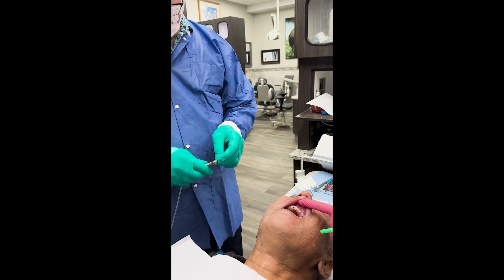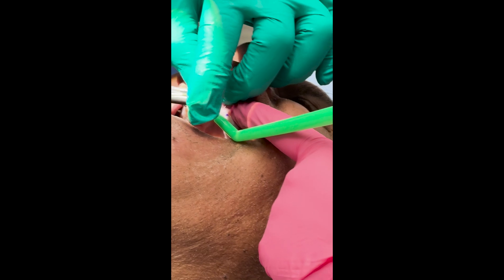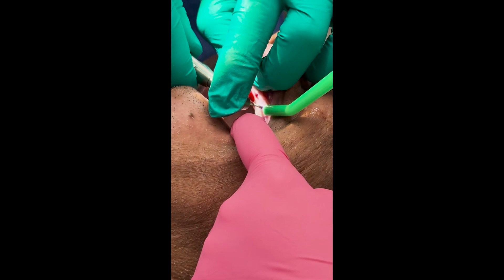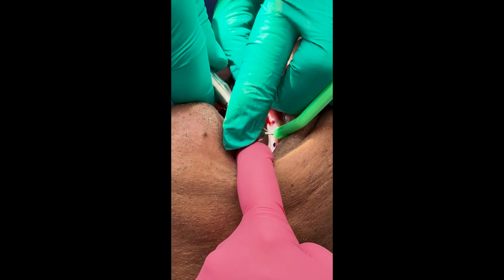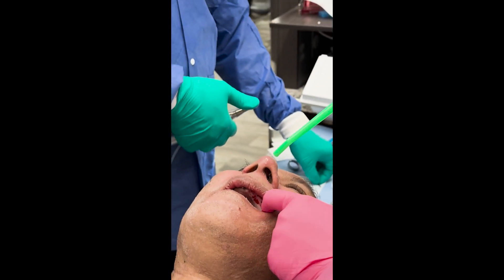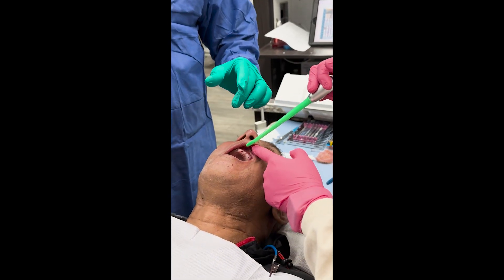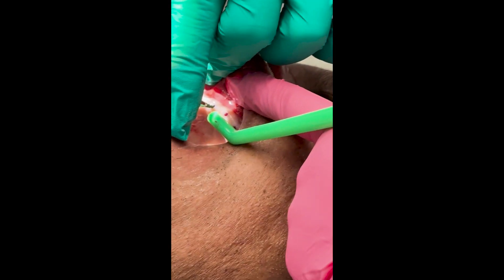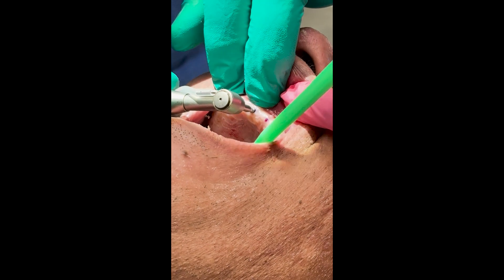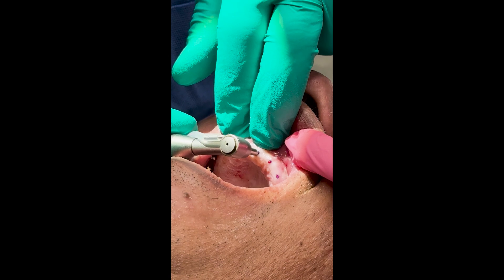Now we'll go ahead and make the other holes on the left side. Any pain at all? We're getting good torque here at the number nine tooth and we're up to 60 newton centimeters now.